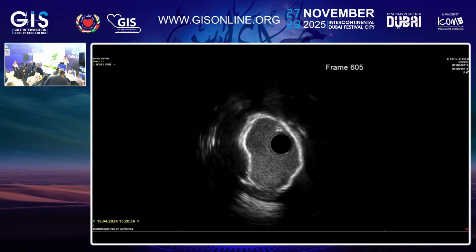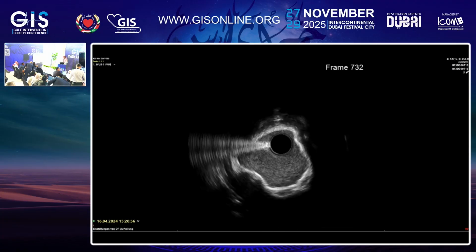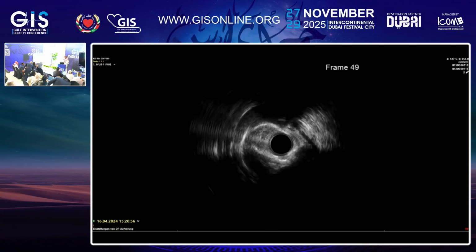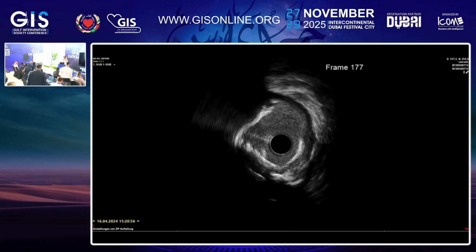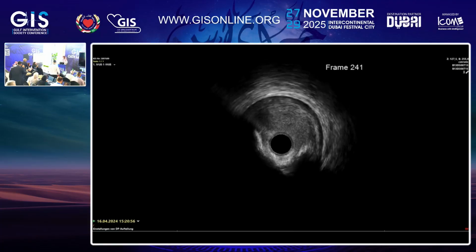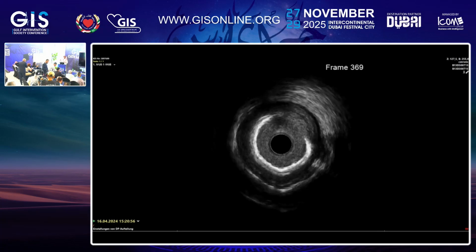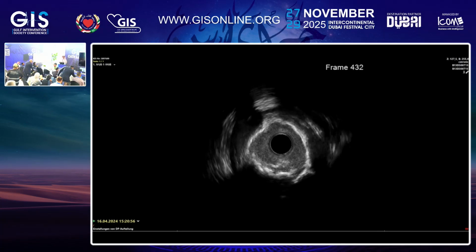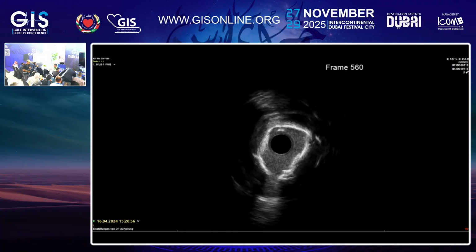I want to see what is my length of the lesion. Second thing, what is the degree of my calcification? Do I need to do anything? Do I need to modify? And the last thing, what is my stent size? So each one of you, through the workflow with the team, we're going to show you how to reach that information before we move to the next step.